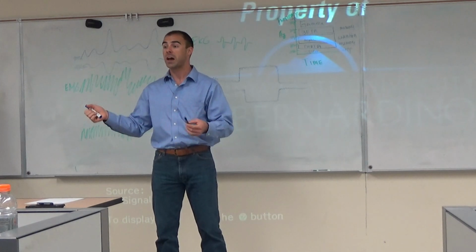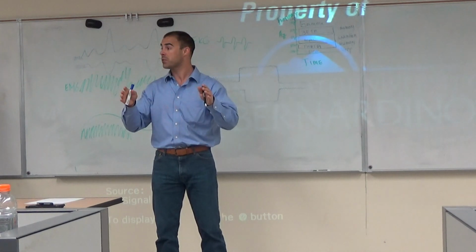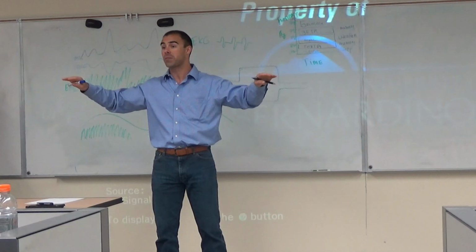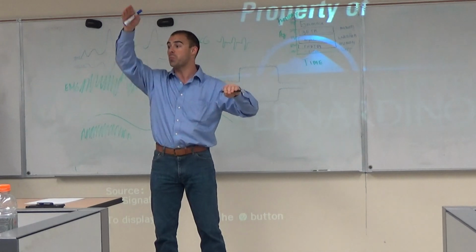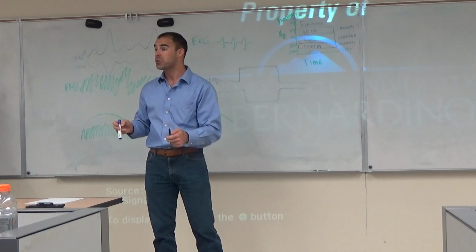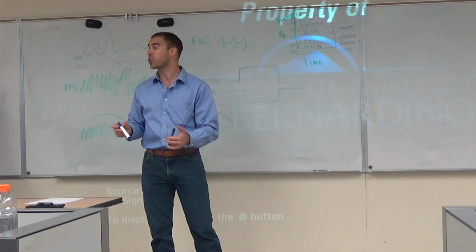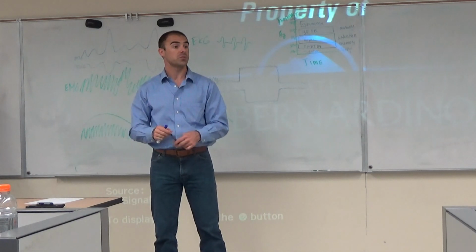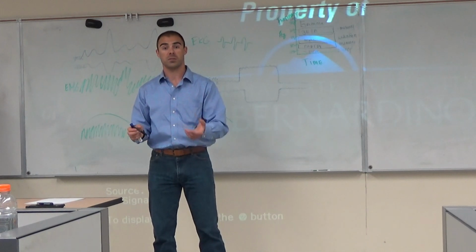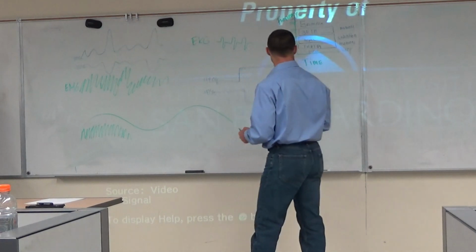If you have hundreds of trials, if you have enough trials, you can average them together, so that the noise will wash out over the averaging process, and you'll be left with whatever the neural signal is that's the same among all those trials that are averaged. But you need a lot of those trials in order to achieve that. Okay? And that's one of the reasons why we have so many trials, so that we can be well suited for dealing with that noise that's inherently in the signal. Okay, so that's pretty good.